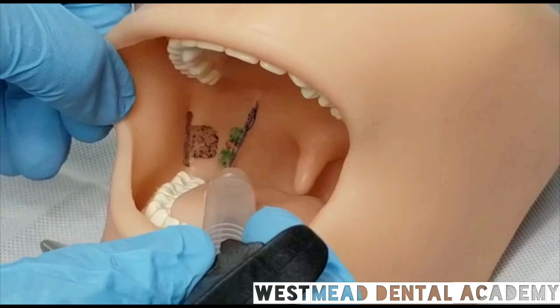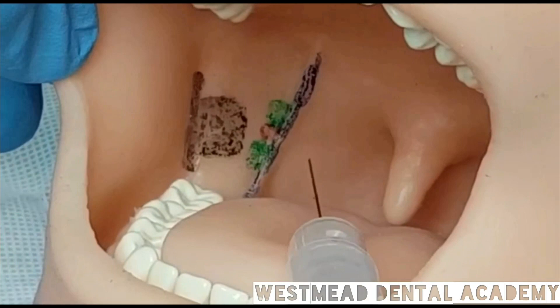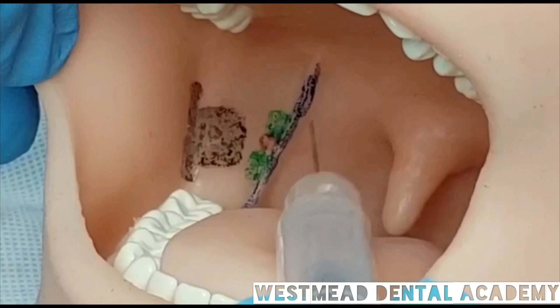So, the main difference is the distance of the entry point to the fold. In the patient's mouth, the entry point — which is the red color point — is away from the fold by about 4 to 5 millimeters. But in the mannequin, it's very close to the fold, which is about 1 millimeter laterally, as it was shown before.